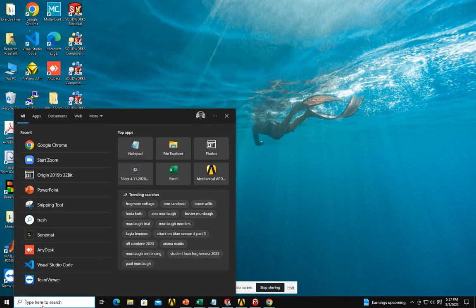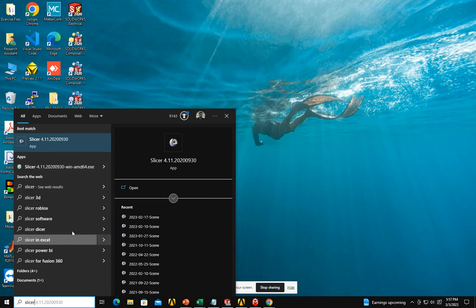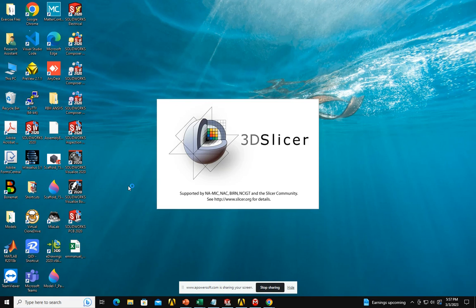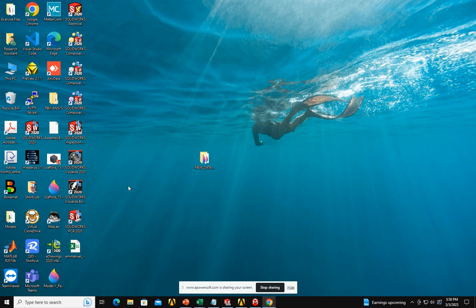The software we need is Slicer. Open it — it looks like this for you.